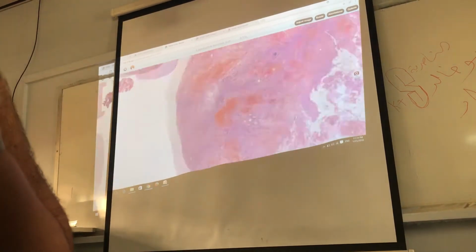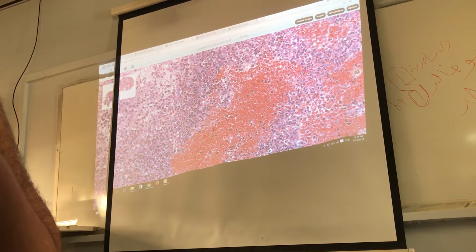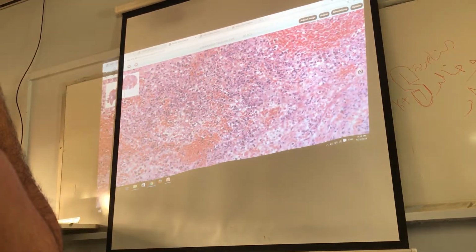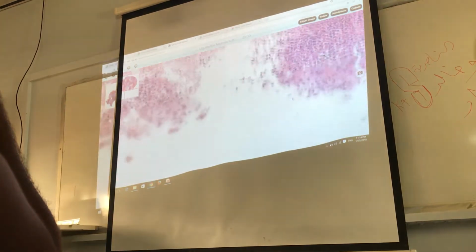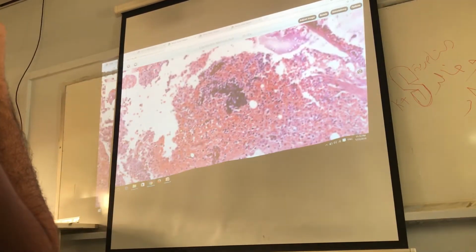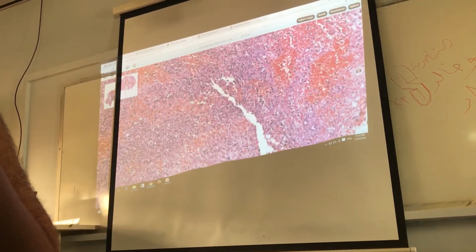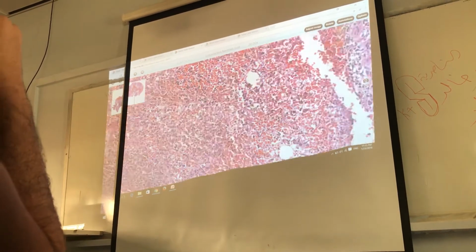If you watch here, with the arrows you can shift. You are seeing everywhere there are sheets of neutrophils. Okay?